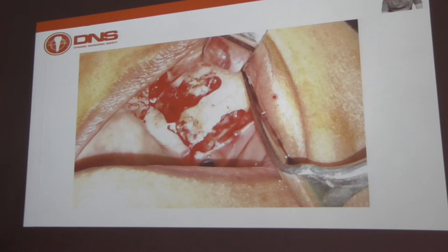I have not started drilling. I always create a groove slightly wider and more palatal, because it gives me the freedom to adjust my angle. If we do not remove adequate bone at this level of the crest, invariably you will not be able to tilt your implants towards the buccal and you will go more towards the orbit. So we have to reduce more on the palatal side so that I can shift my burr and come out in the zygoma and not towards the orbit.